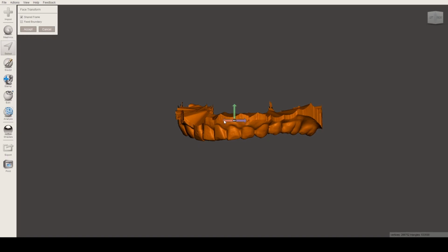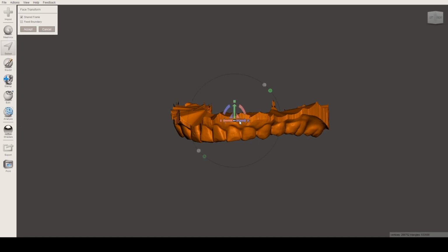Oh, nope, it expanded again. You know what, let's just skip this part because it's making my computer laggy. Sorry about that. But yeah, we can do nothing much from now on.